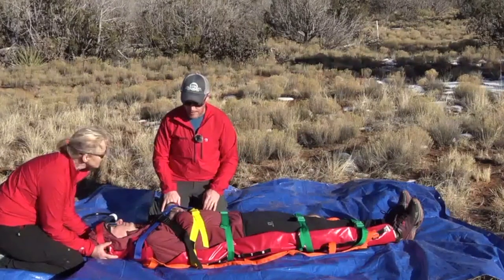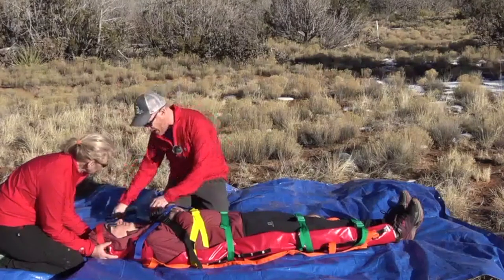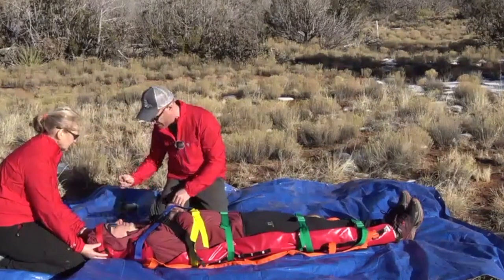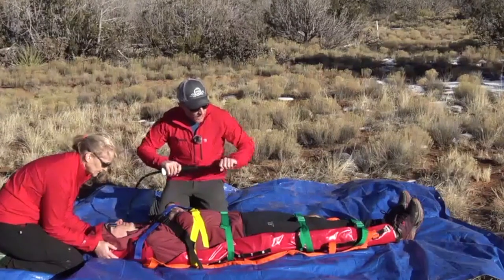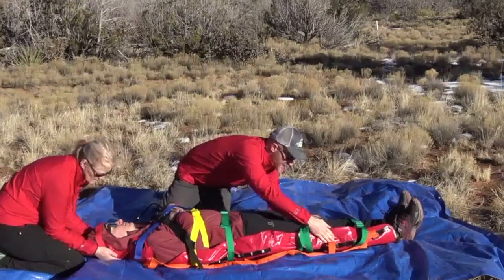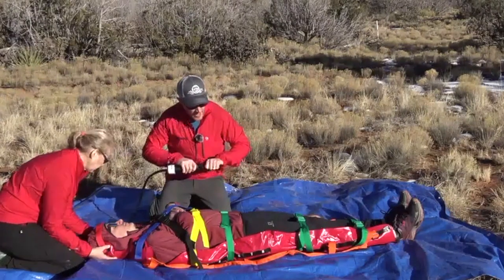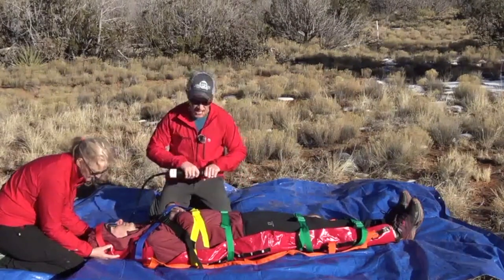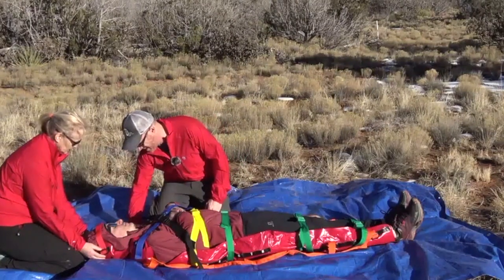Now we have our straps in, we're satisfied with how they're positioned and the degree of tightness, and they're not causing undue discomfort. So I'm ready to deploy my vacuum. I've got my pump — I'll go ahead and check my valve, making sure it's closed all the way clockwise until it's snug and hand tight. Go ahead and insert the working end of the pump; it just friction fits, there's no lock or anything like that. Now I'll start to run my pump and deploy the vacuum on the mattress. As I do this, I can do some additional molding. I'll continue to run this pump until I start to see the beads become very prominent on the patient side of the mattress and I start to feel a decent amount of resistance in the pump — that tells me we've now got an adequate vacuum. I'll go ahead and detach the pump.